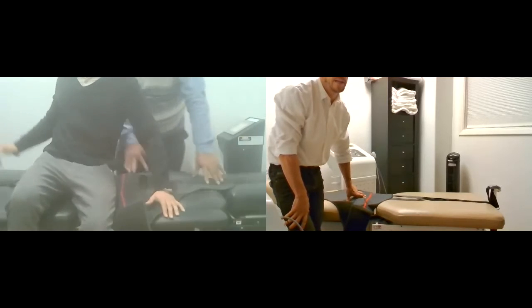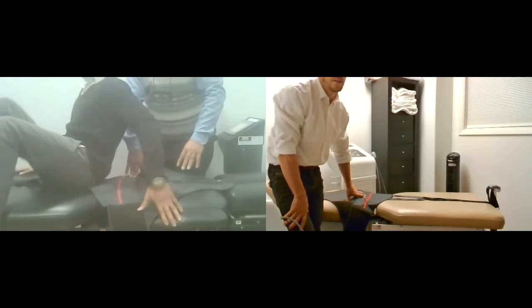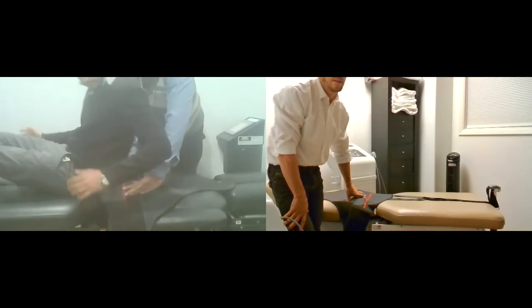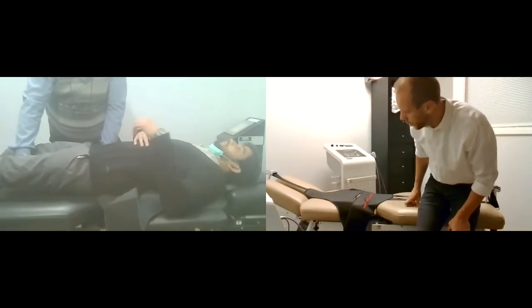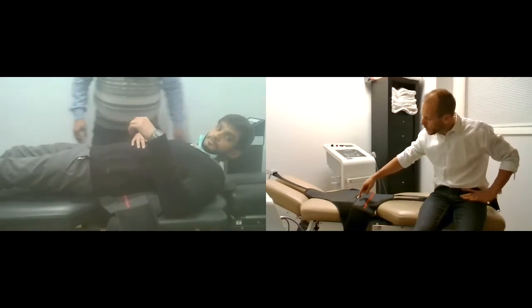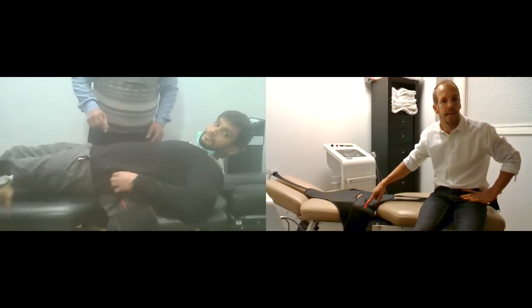Go ahead and lay on your back. Perfect. Now, the first thing we want to do is line up his iliac crest with the top of this pelvic harness, or the ASIS with this red line.